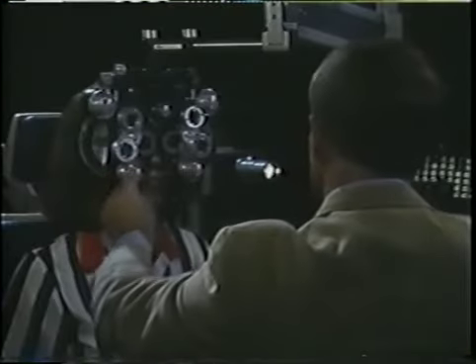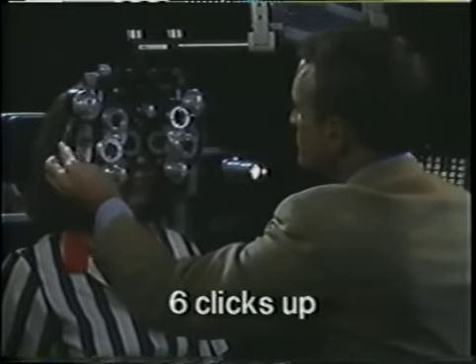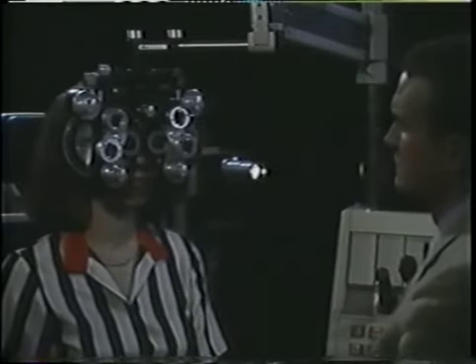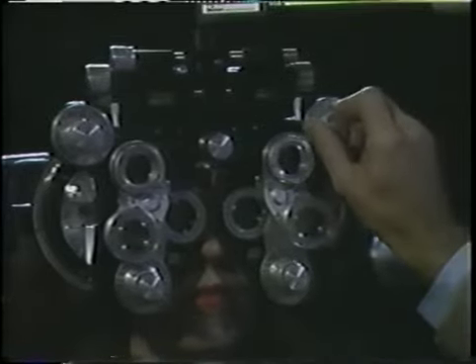Now, comparing the principal meridians as I move slowly back to the working distance. And they appear to be neutralizing equally as I move back. The neutralization is finished. After neutralizing the left eye as well, dial 6 clicks up on both sides to compensate for the working distance, moving the patient's far points to the visual acuity chart at the end of the room. Occlude the left eye and take a visual acuity for the right eye.